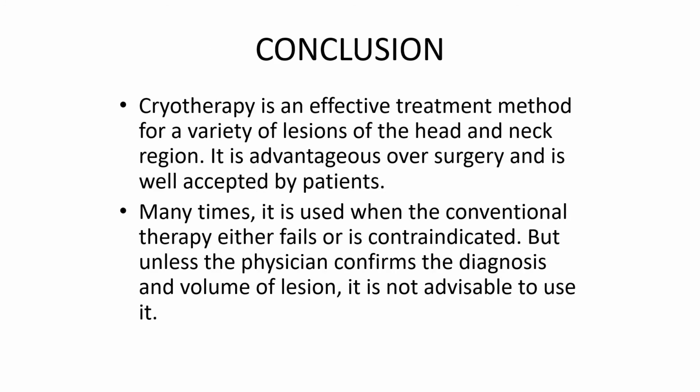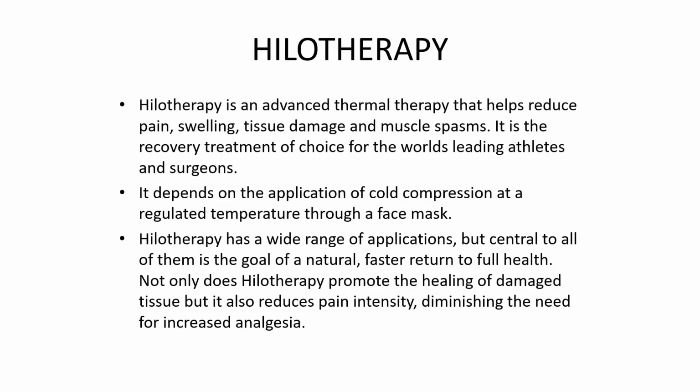هسه نجي على conclusion. Cryotherapy is an effective treatment method for a variety of lesions of the head and neck region. It is advantageous over surgery and is well accepted by patients. Many times it is used when conventional therapy either fails or is contraindicated, but unless the physician confirms the diagnosis and volume of lesion, it is not advisable to use it. بس الموضوع الثاني اللي هو الهيلوثيرابي.